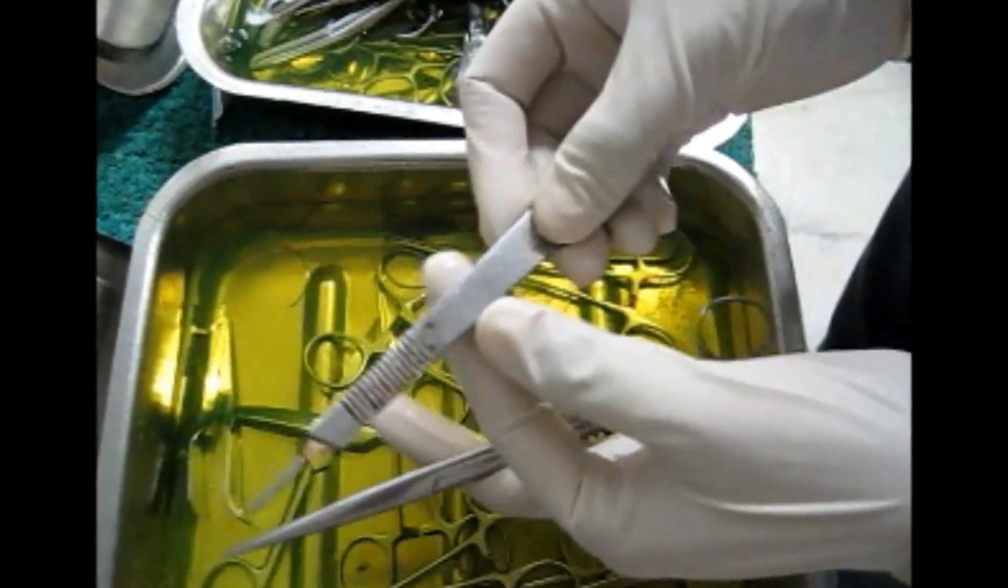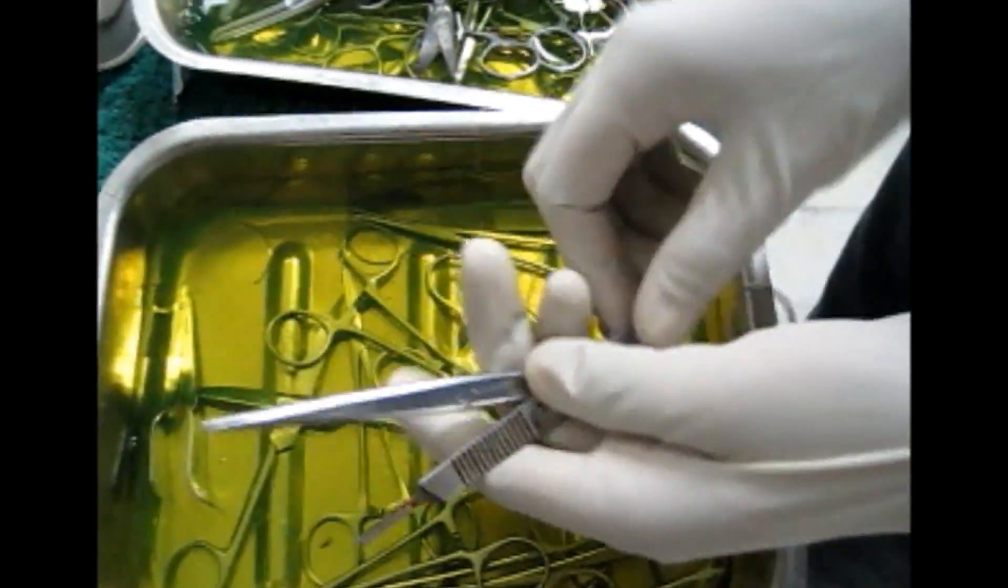This is the plain scissors. You can see very clearly. This is the BP handle.